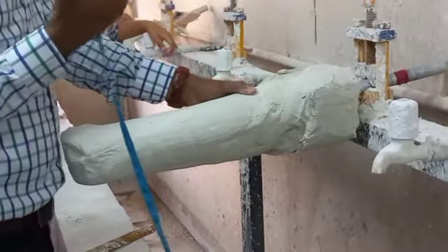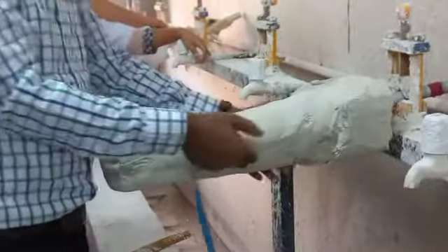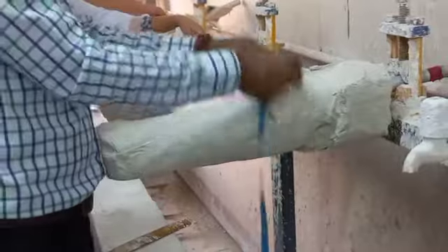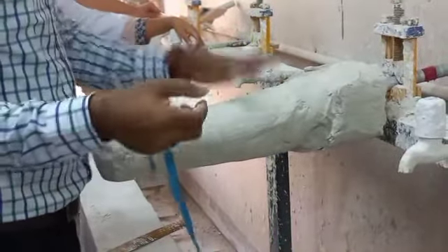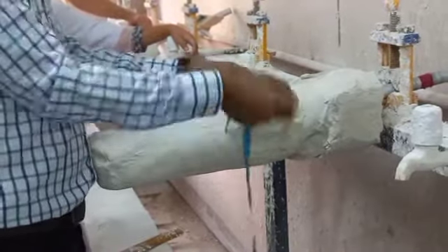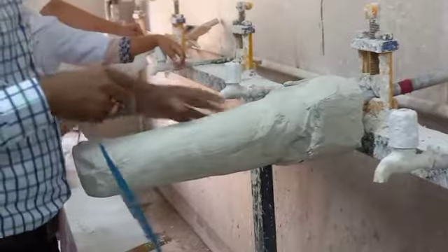So understand this fact that I made this mistake: after removing the plaster bandage, I must first remove some ridges of the dust, and then take the measurement, and then start our modification. In this case, this was a model. That day we did not have the measurement either, and therefore we were not able to compare it. Otherwise I would have definitely gone for it, okay, we have this measurement before doing any modification, right?